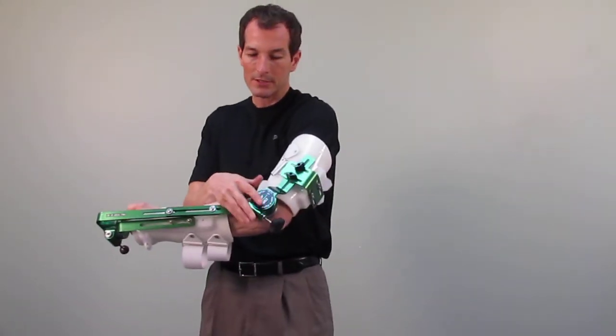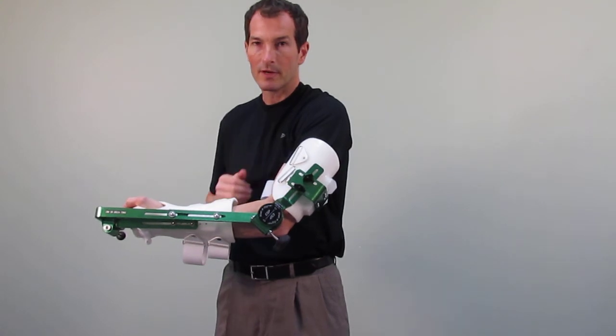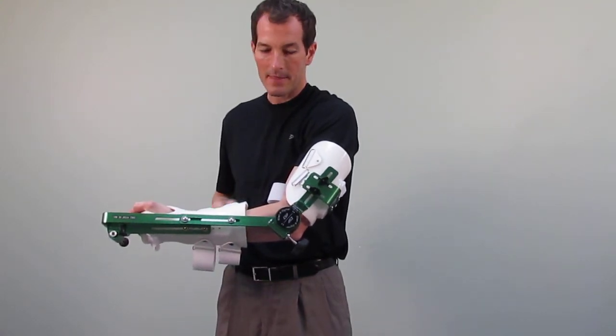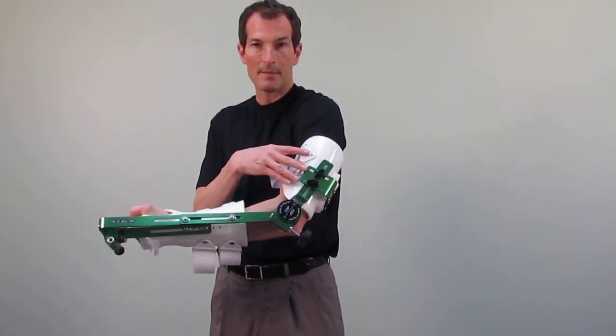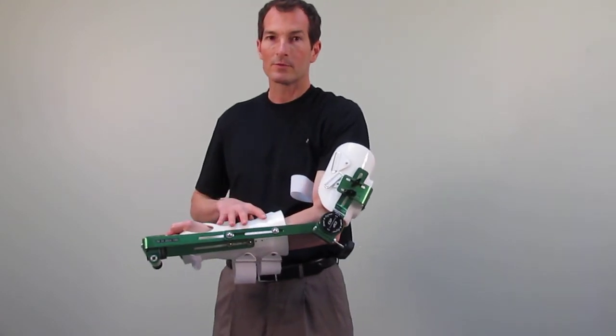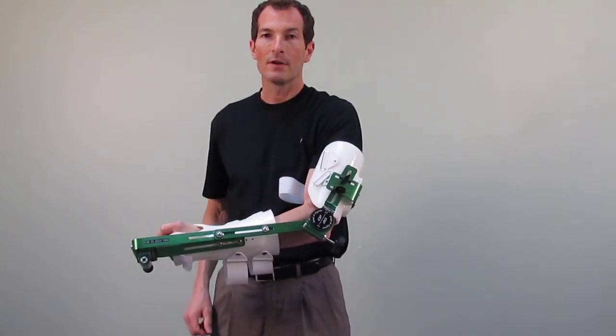The elbow hinge should align with the elbow joint appropriately and then the proximal straps may be fastened and then the forearm straps may be fastened in order to utilize the device.